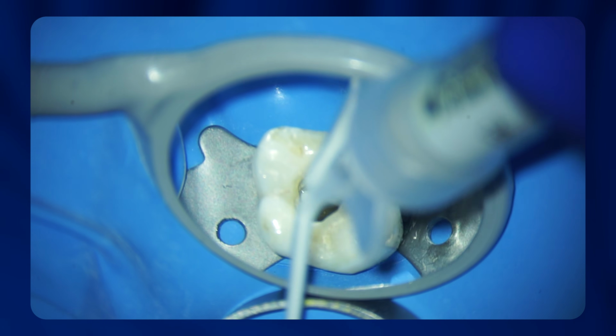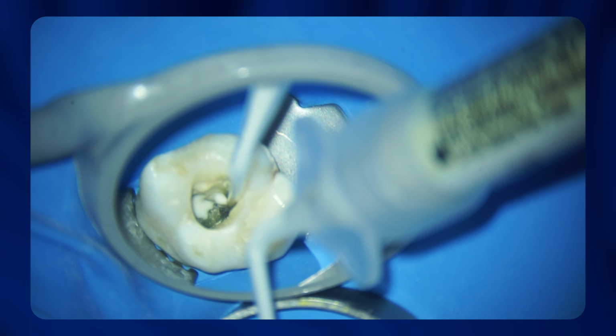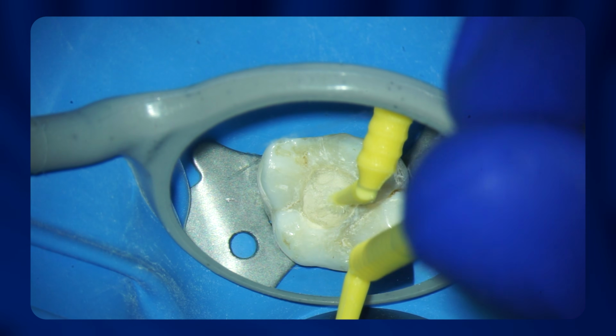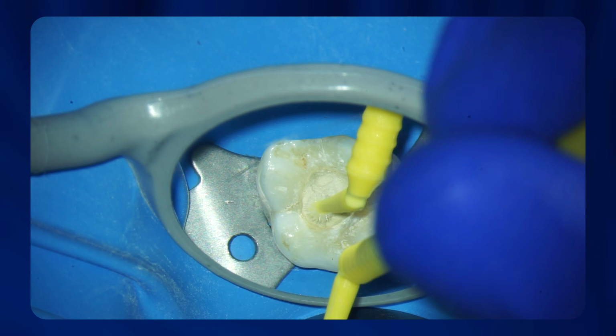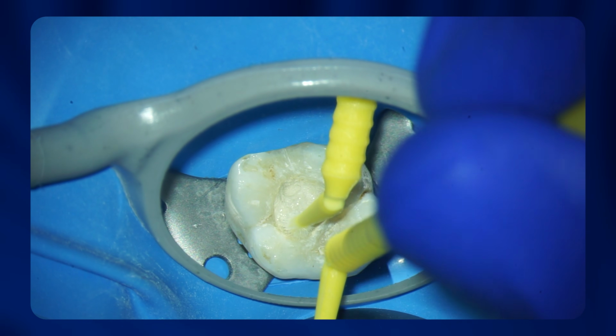So here's what we do in everyday clinical practice. We put calcium hydroxide in the canal, and then we don't use cotton pellets or Teflon. We directly put Cavit-G on top of the calcium hydroxide. So we take Cavit-G, condense it into the canal, use a moist cotton pellet or moist microbrush to condense the Cavit-G into the canals. And then once that's done, we cover the Cavit and the topmost part of the tooth surface with glass ionomer cement.